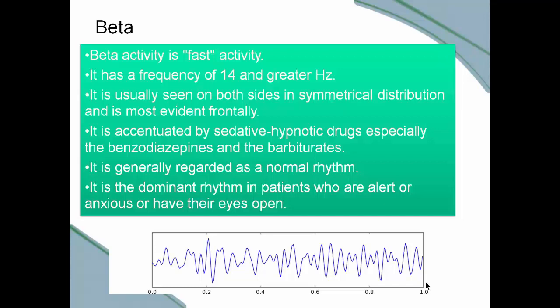And here's an area where EEG feedback has been demonstrated to be quite successful. Only instead of having an ADD individual meditate and try to drive them into alpha, they've already got too much alpha. What you want to do is meditate them or feedback them into more beta. And this has also been demonstrated to be quite effective.